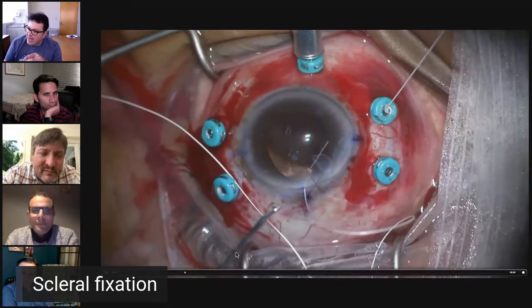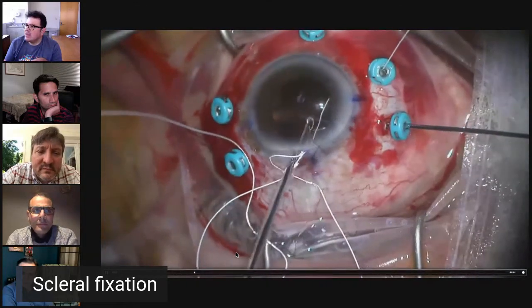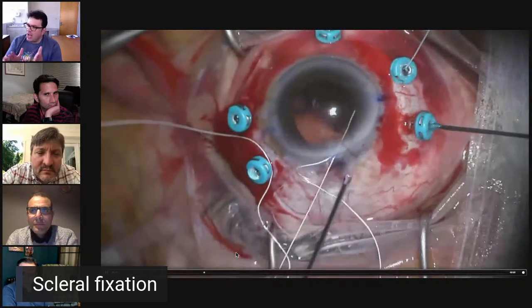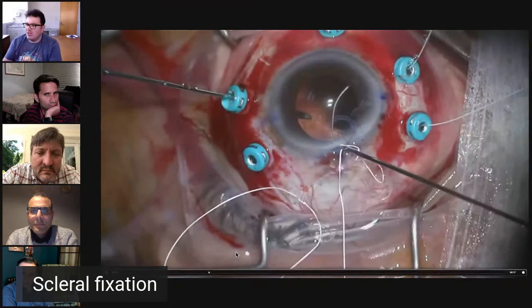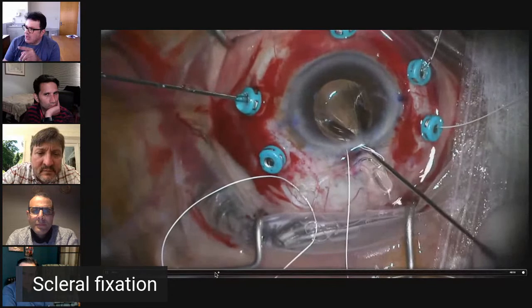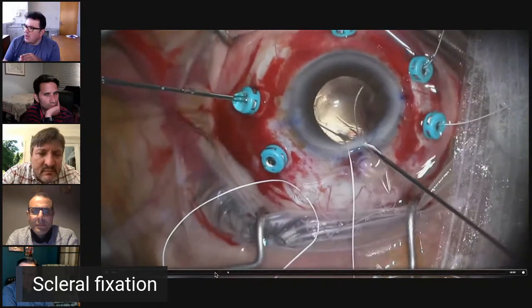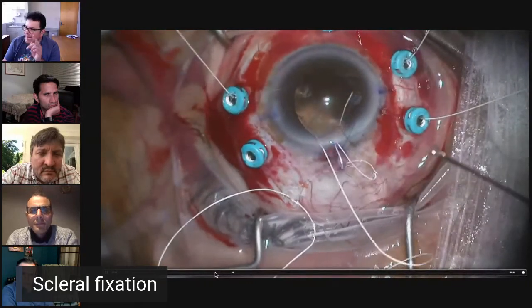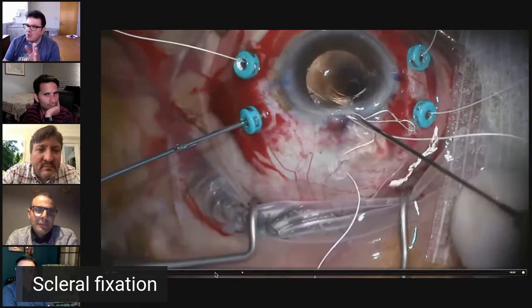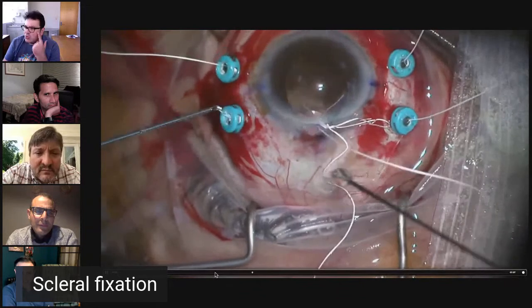And this one has a bigger wound that I closed because I explanted a PMMA lens. And then I do the other one. The trick is always to be outside your first suture, and you'll see that with the other one. So here I'm doing the other side on the temporal side, and when I'm doing the superior one, I need to be outside that suture, and then there will be no spaghetti. So always be on the outside and do the inferior one first, and there will be for sure no spaghetti.